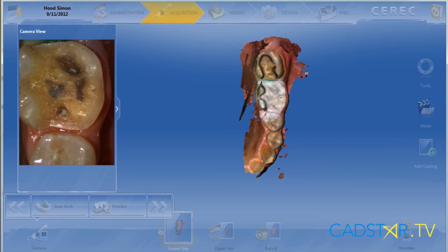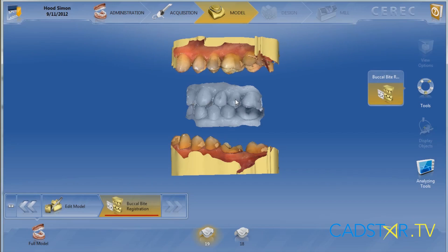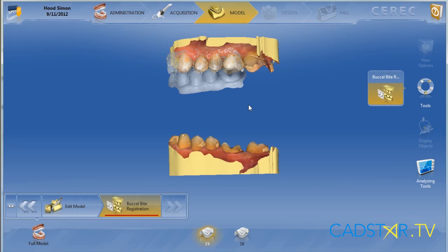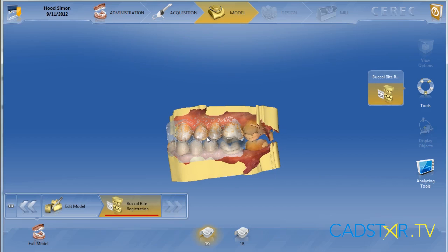This is real time as you see on your screen now — this is the actual time that I spent scanning. In our model screen we'll correlate the models with our buccal scan. The scan was taken prior to the preparation. There's enough digital information to adequately correlate the model and get a very accurate bite.